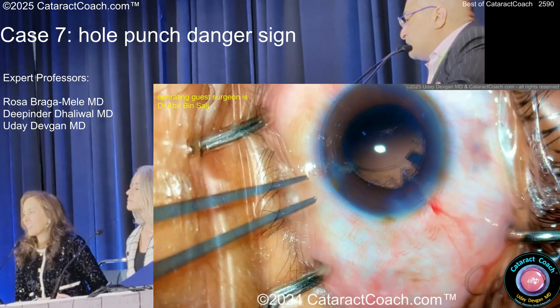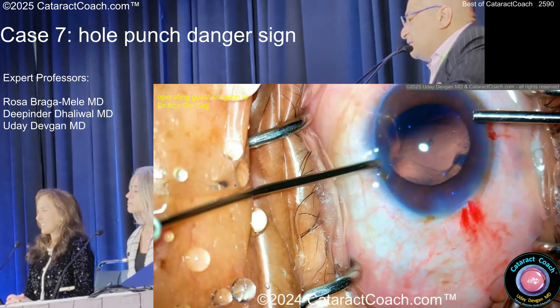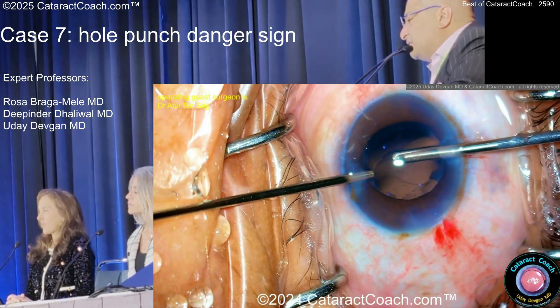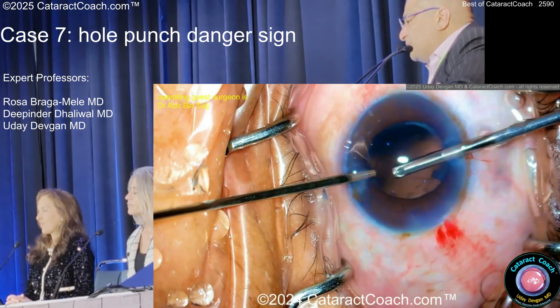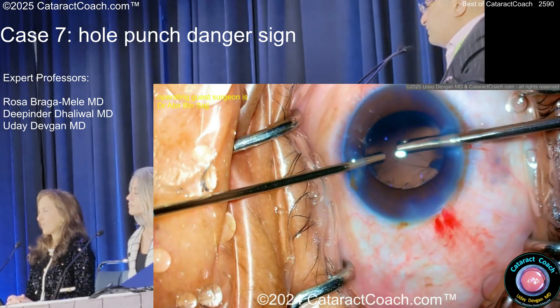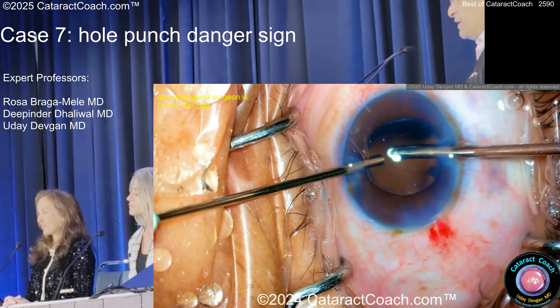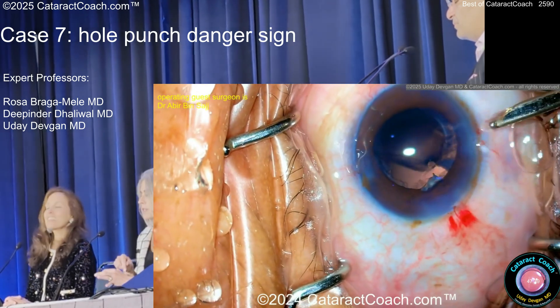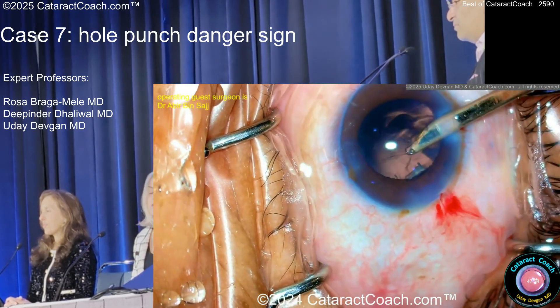The good news — you don't need a YAG. We're going to clean this up, but you're definitely going to have to do the vitrectomy. I like that we're not using the main incision here. I'd love some triamcinolone. If we'd followed that advice, instead of this huge opening we'd have just the one small puncture site, and you probably wouldn't have all this prolapse. When you do have that one small puncture site, you can convert that to a posterior continuous capsulorhexis, and then it won't widen like that when you start taking out your cortex.